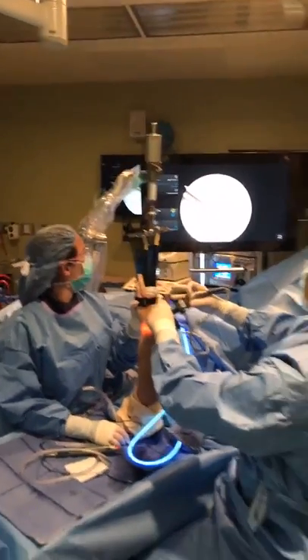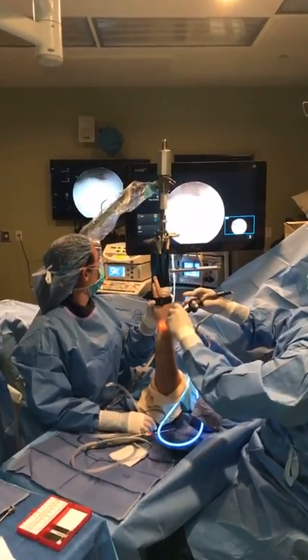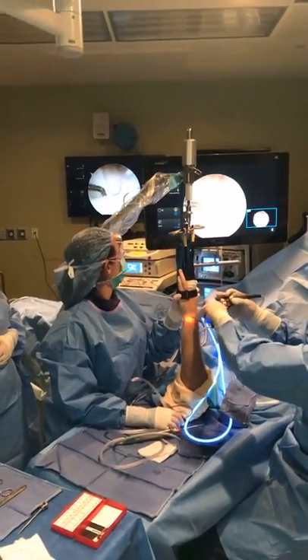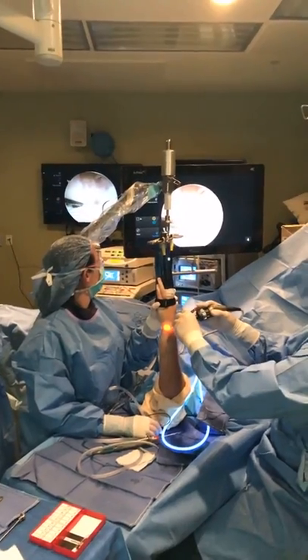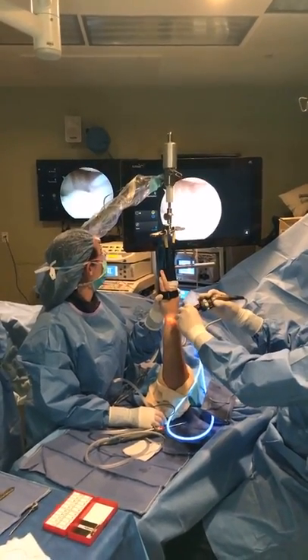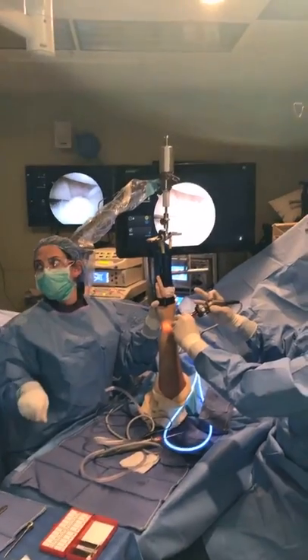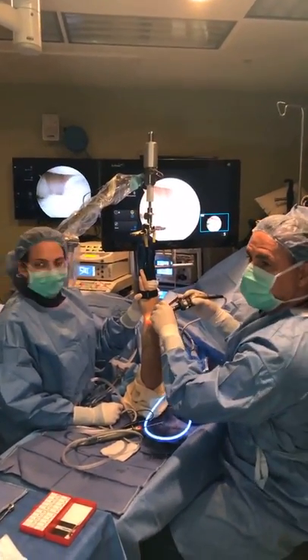So this should be tight as a drum. And I can lift it off there. So I am going to prepare to repair it to the capsule here, to then restore the tension. Okay, I got a good picture to lift off or no? So let's open the TFCC repair kit, please.